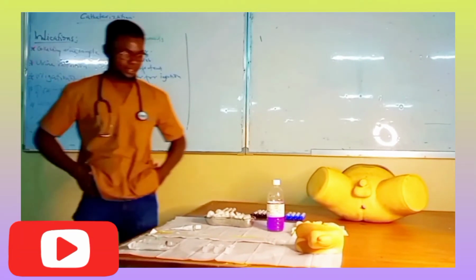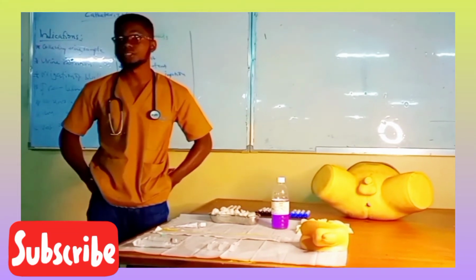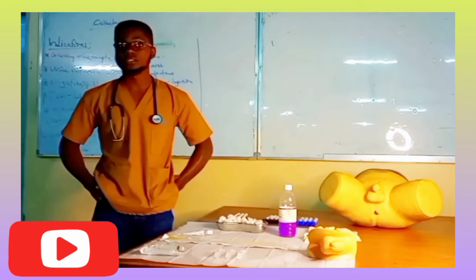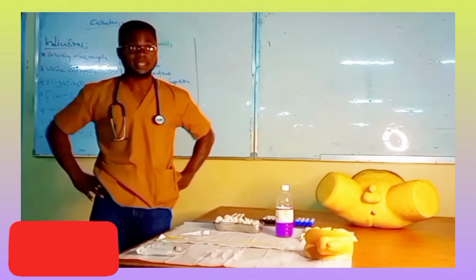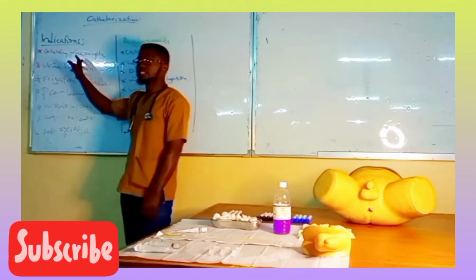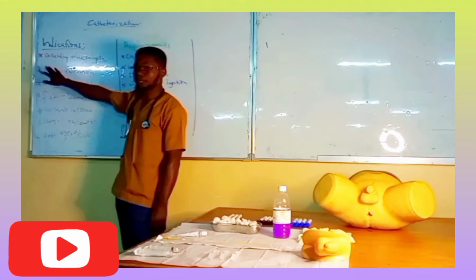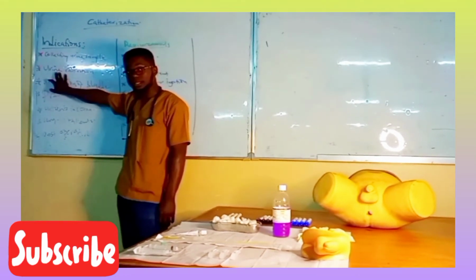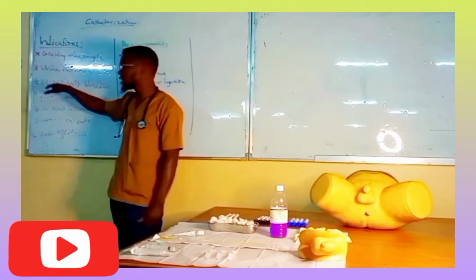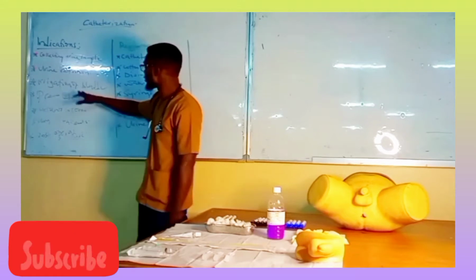So we are going to look at our procedure today, and that is catheterization. We saw some of the indications for why we do catheterization. Some of the indications are collecting a urine sample from the patient; when the patient has severe urinary retention, we need to catheterize to drain the bladder; and when we need to irrigate the bladder to wash away certain infections.